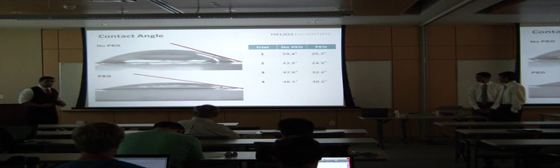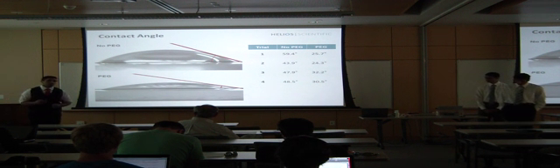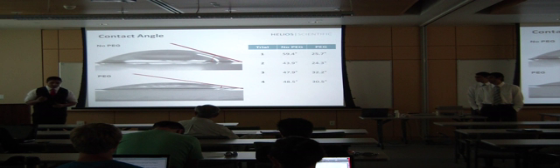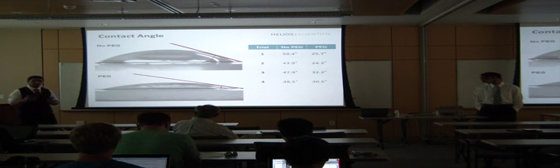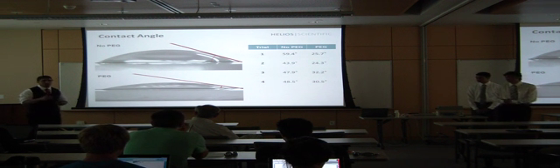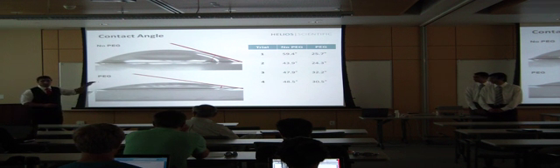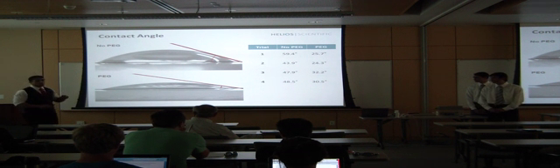So after looking through literature and talking with faculty, we found out that the best solution for this is using polyethylene glycol. It's a very, very hydrophilic substance, so it will not interact with the oils and the fat during surgical operations. There's a lot of interstitial fat that the glass can rub against, leaving smudges. So what PEG does, being really hydrophilic, it will not interact with those oils.